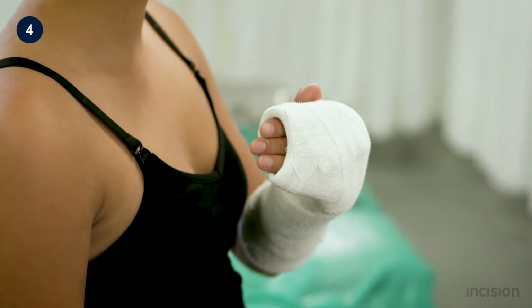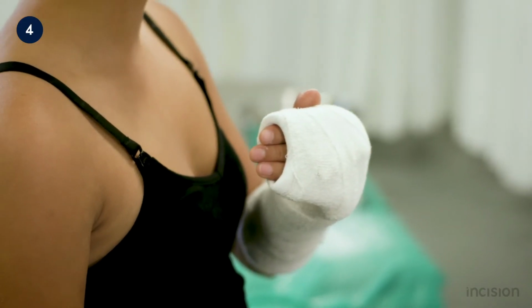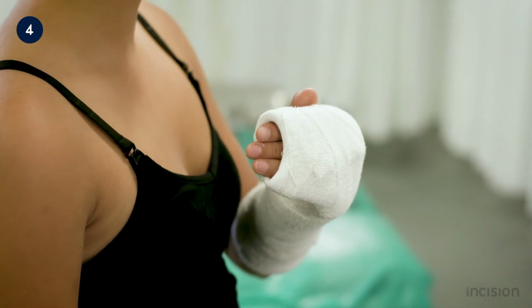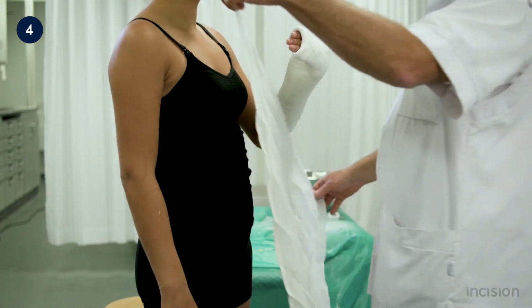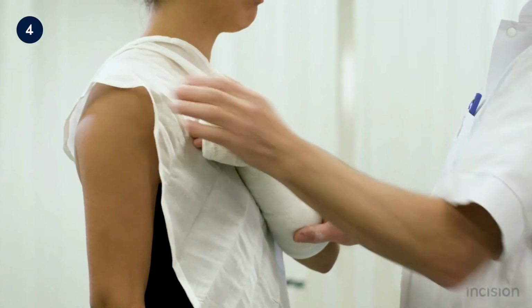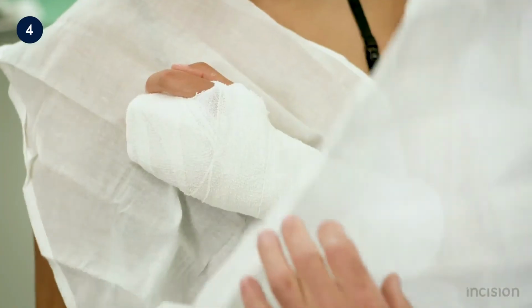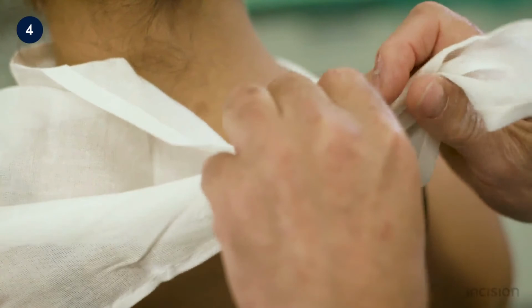Note that the application of the triangular bandage is demonstrated using a clip from a different film, ulnar gutter splint. The application is the same as for the volar forearm splint. The longest side is positioned over the shoulder of the unaffected arm. The other side is positioned over the shoulder of the affected arm. A reef knot is used to fixate the triangular bandage.